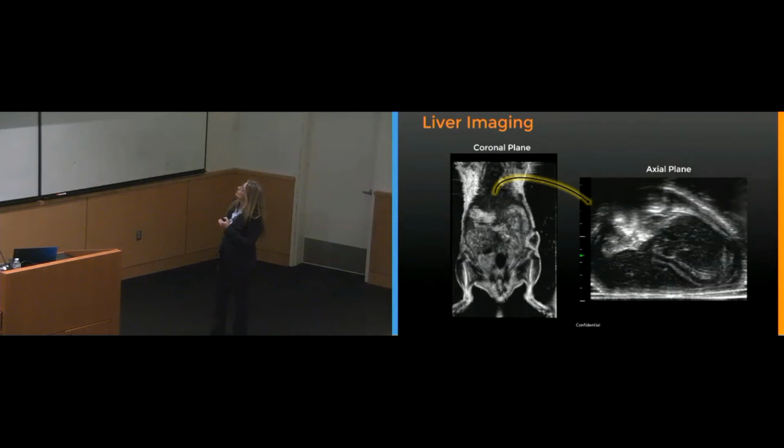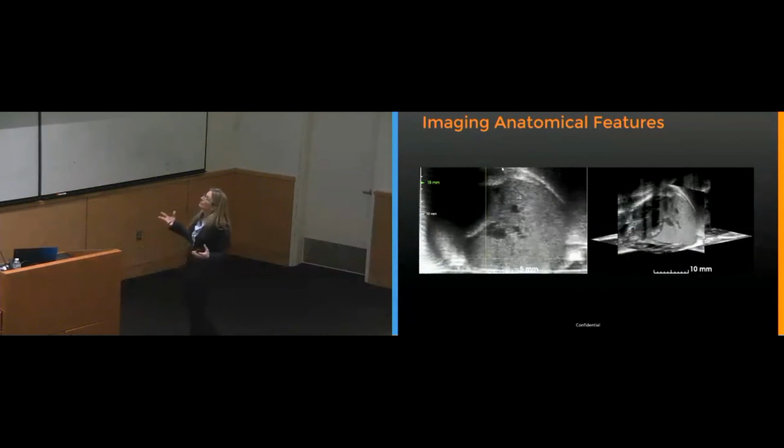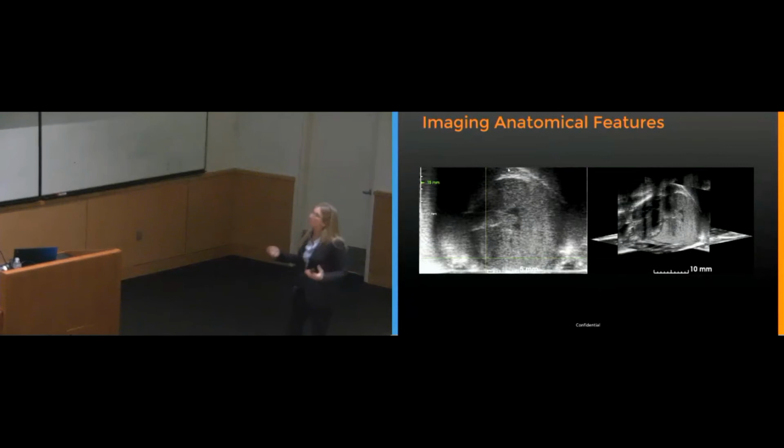This is actually a piece of gut interfering with the liver. As I mentioned, we're doing a lot of NASH studies, and then the liver becomes very bright because of the steatosis. The fat in the liver makes the liver very bright. First it was very dark, but as you could see in these movies, it becomes very bright. And that's a readout parameter for the amount of fat, the steatosis in the liver. And so that's very popular.